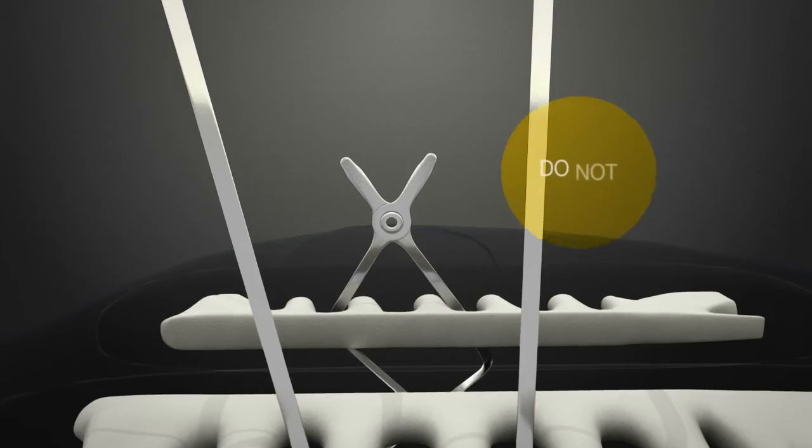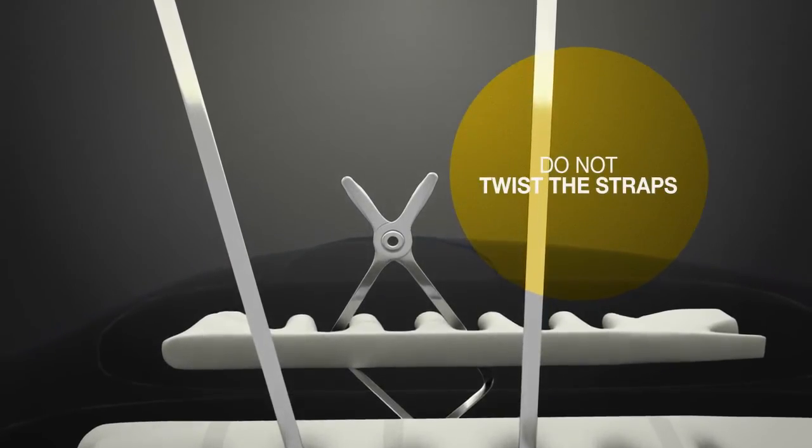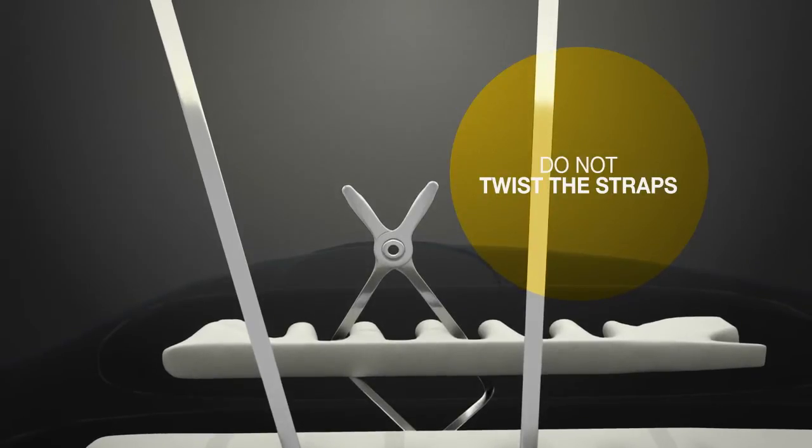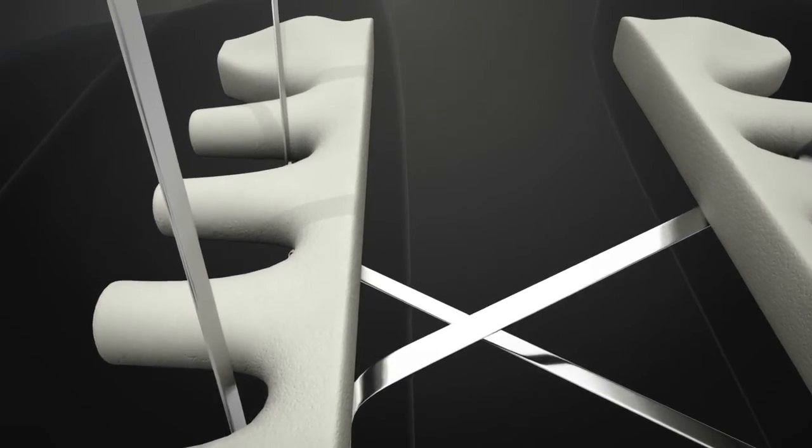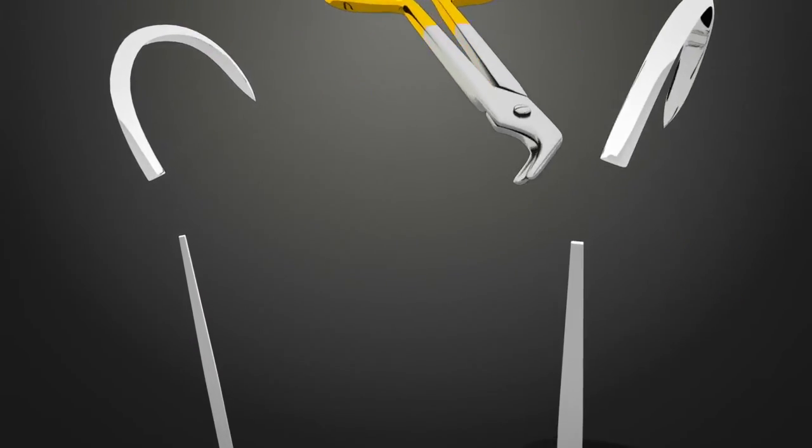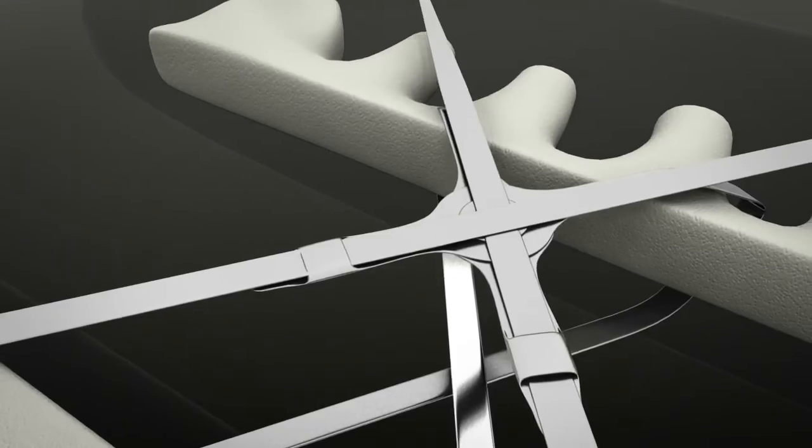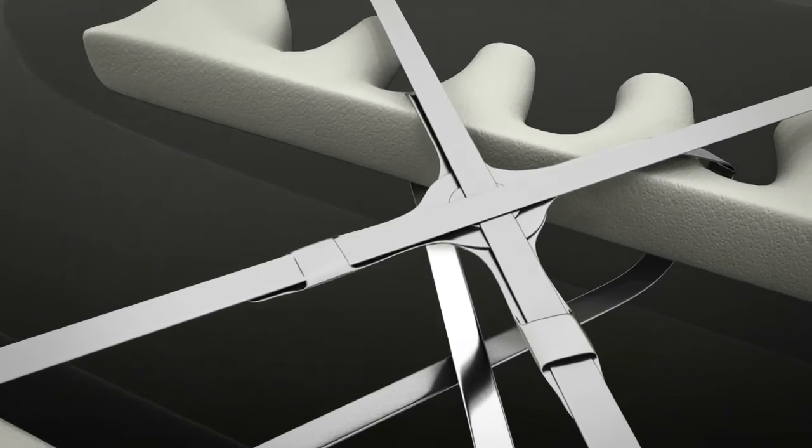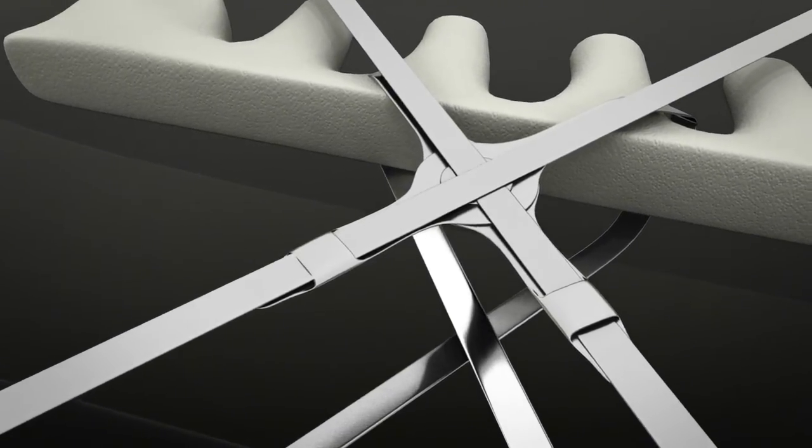Do not twist the straps while performing this placement, as it will prevent tightening of the straps. Once both straps are through the near sternal half, the needles are cut off near their origin. Then the straps are passed through the appropriate security box. The strap and security box should match up in alignment.